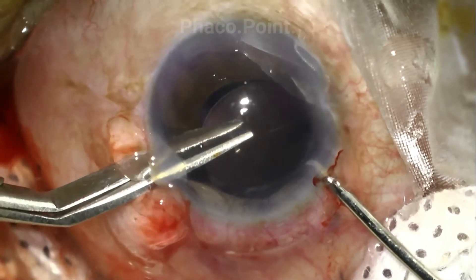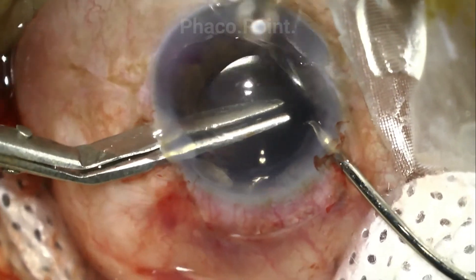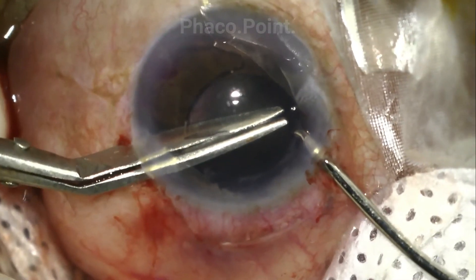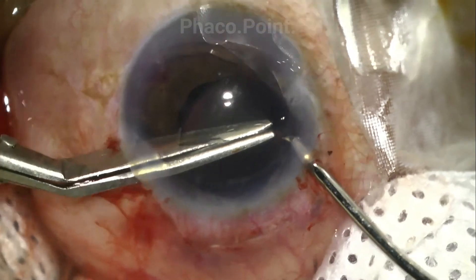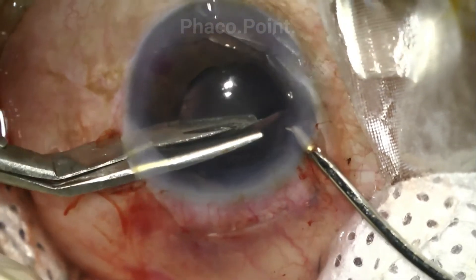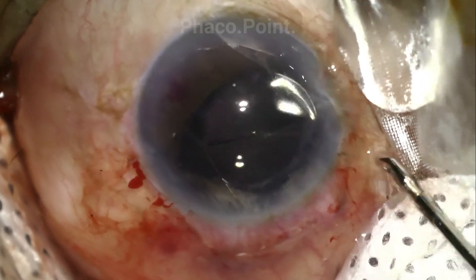The surgeon then introduces scissors into the eye and starts to cut through the middle of the optic, up to and just beyond its centre. It is very important to maintain a firm hold on the optic with the intraocular forceps held in the non-dominant hand throughout the process of sectioning the IOL.